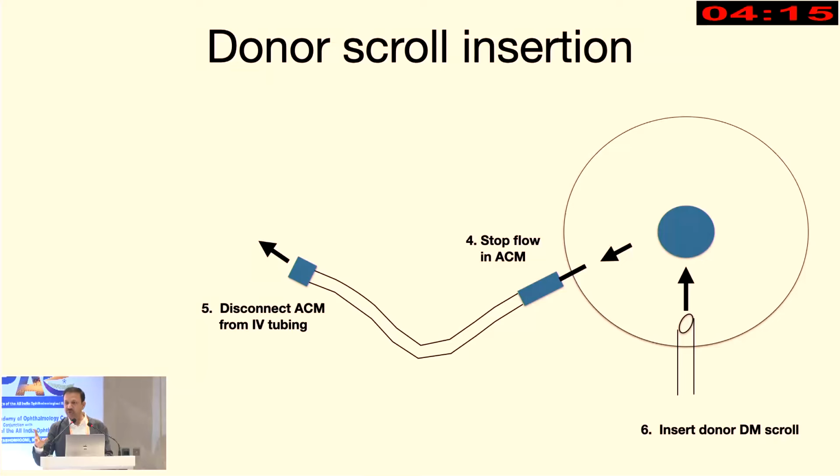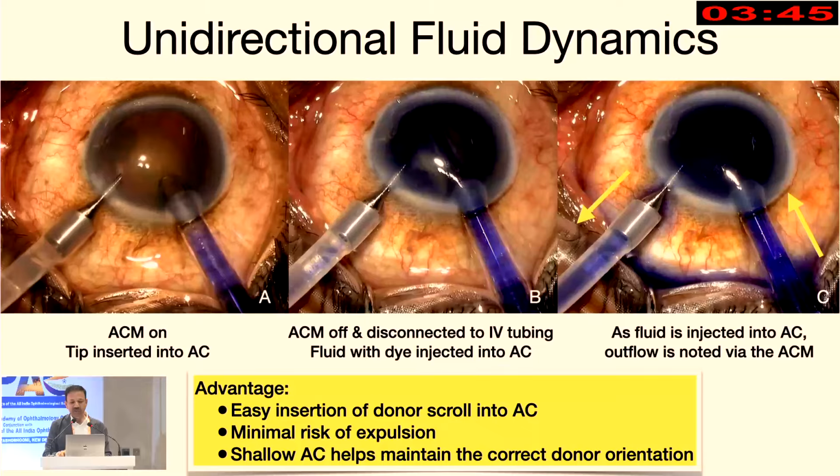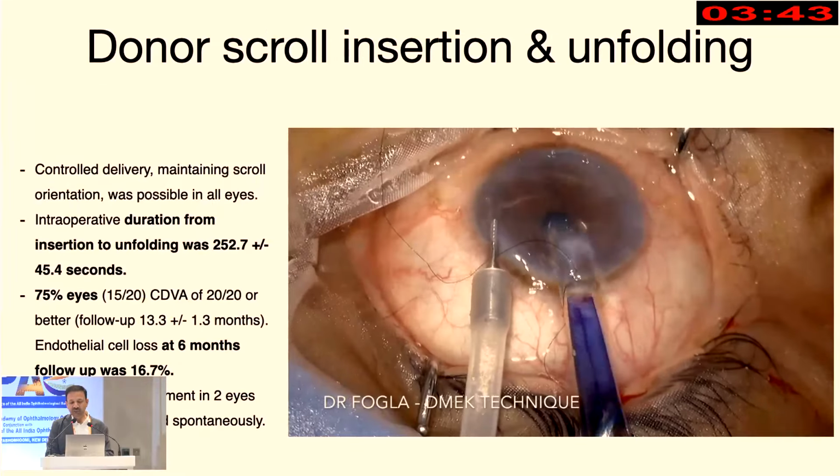So then, at that point of time, you push your scroll into the eye. There is no counter resistance, so the fluid flow is easier. Your scroll goes into the eye without too much resistance, and once it goes into the eye, the chamber does not remain deep because you have fluid leaking out from the AC maintainer. So your chamber shallows, and the inferior iris and the cornea will catch your donor tissue. So when you are removing the tip of the cartridge, you won't have the tissue trying to jump out. So that's the advantage of doing it, and you can see that in this video that we have.